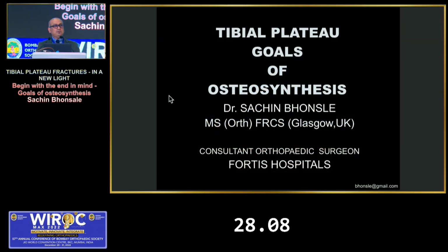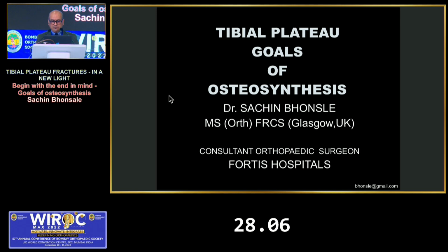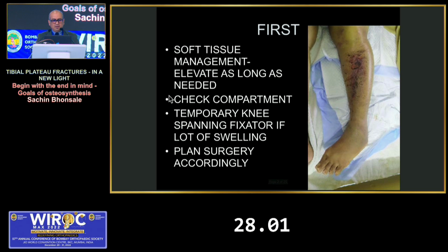I'm going to talk about goals of osteosynthesis in tibial plateau fractures. First, many tibial plateau fractures come with a lot of swelling. So it's important to manage the swelling, check the compartment, and check for any other soft tissue injuries. If there is a lot of swelling, it's good to put a temporary knee fixator, and let the swelling settle down till you get an opportunity to safely operate on the patient. Not too early, not too late. This is one of the examples here.